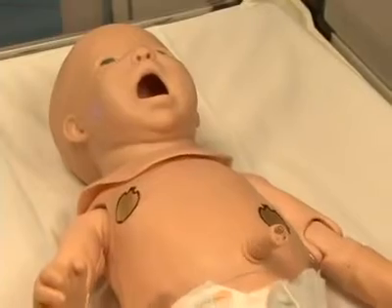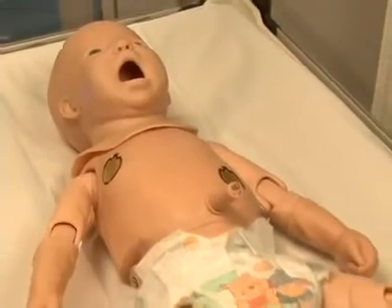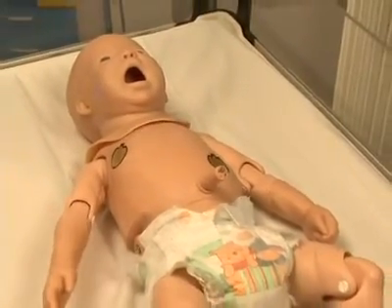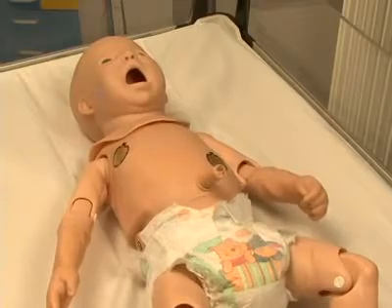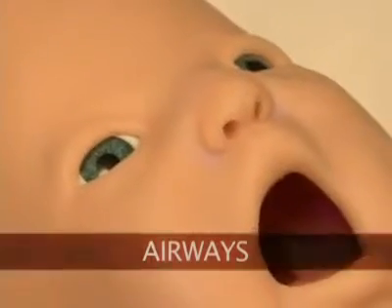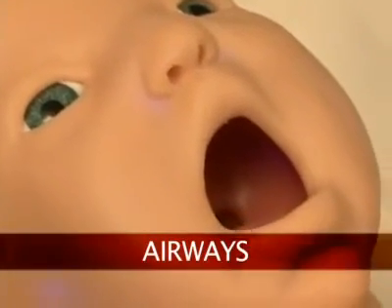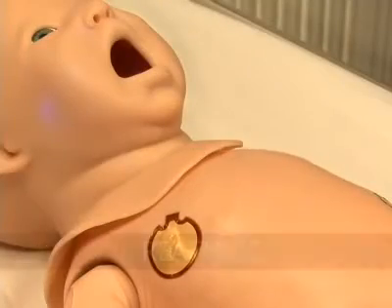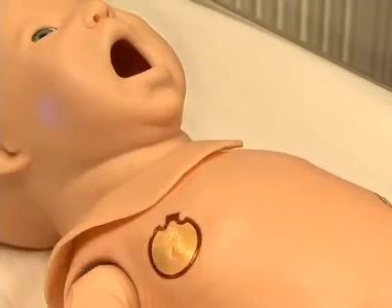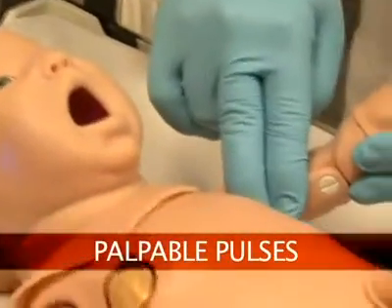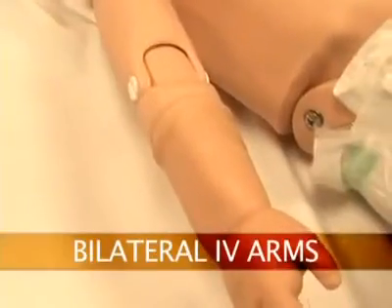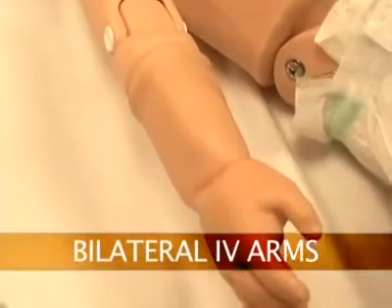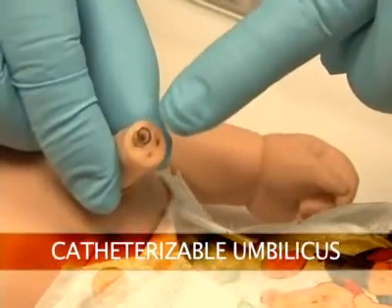Now that your newborn HAL Total Mobile Solution Simulator is ready for use, let us take a tour of many features such as a realistic airway, breathing, palpable pulses, bilateral IV arms, and catheterizable umbilicus.